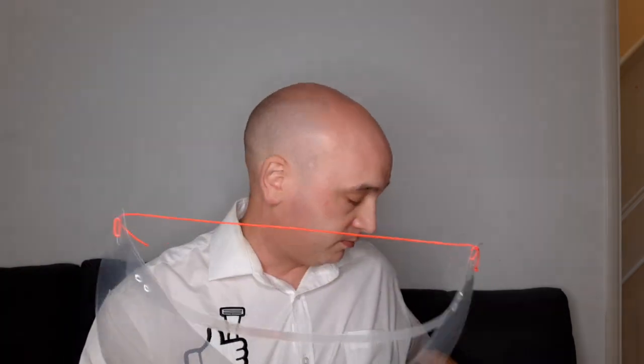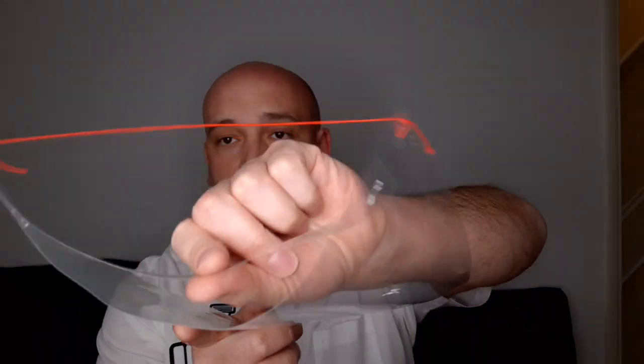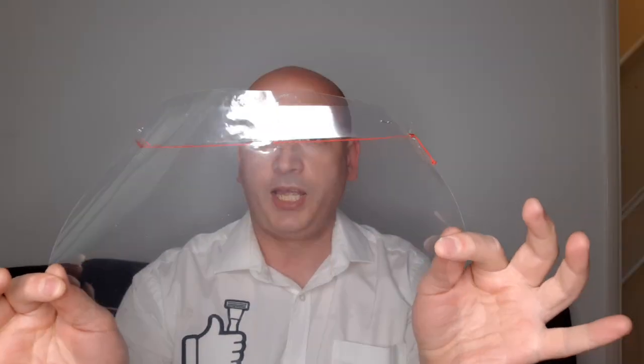So apart from replacing the elastic band, I've managed to get elastic cord. However, elastic band still works perfectly well if you get long enough elastic bands. Had a look at some other ones and decided that actually what's best is to get the laminated sheet, although this is an A4 in landscape. Get a laminated sheet and cut in portrait so you get a bend there.